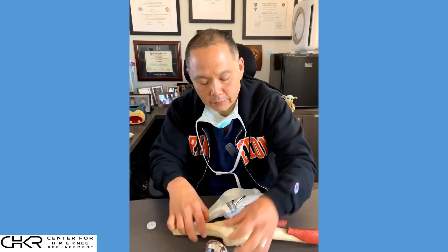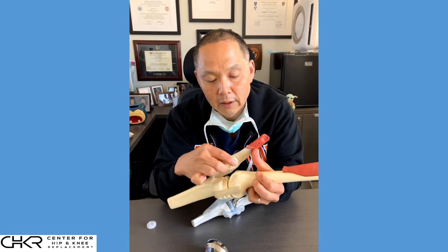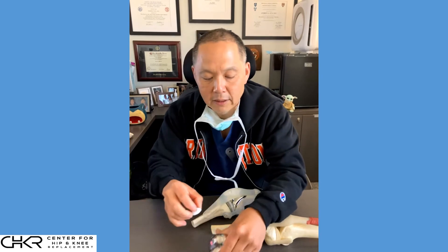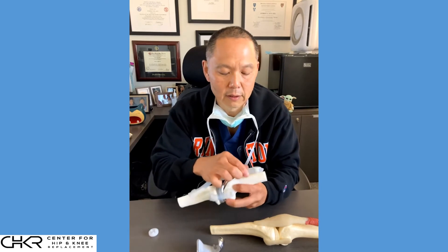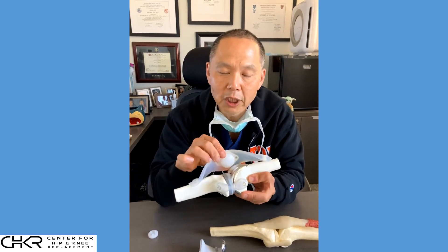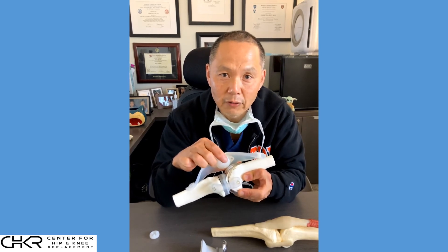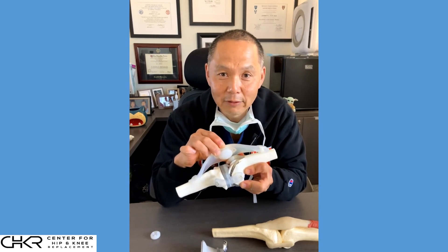So again, a native patella sits in the middle of a groove. The undersurface gets removed and replaced with a button, which then tracks with the femur. We can see the button on the undersurface sitting in the groove. We're not replacing the whole bone — just the undersurface, the area where there was previously cartilage, replacing it with a button so that it can glide against the metal surface of the femur. That is a patellar resurfacing.